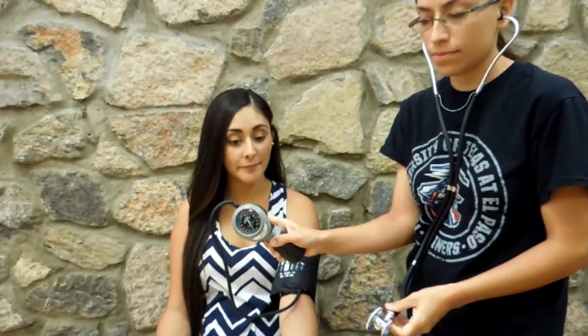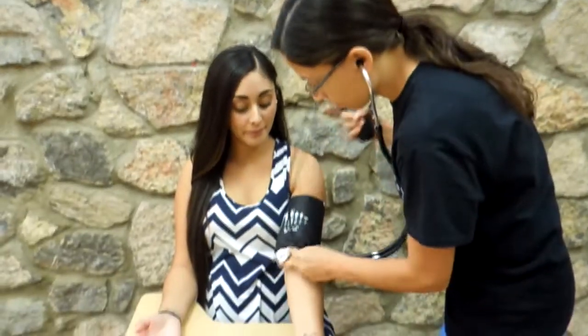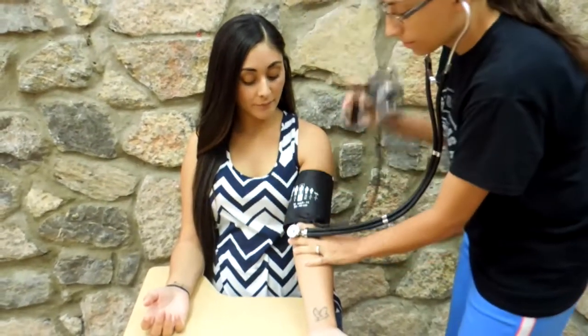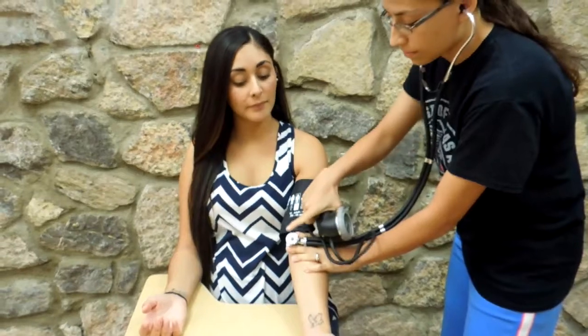The stethoscope chest piece must be placed over the brachial artery below the antecubital space. Do not place fingers on the chest piece, as this can yield inaccurate readings.